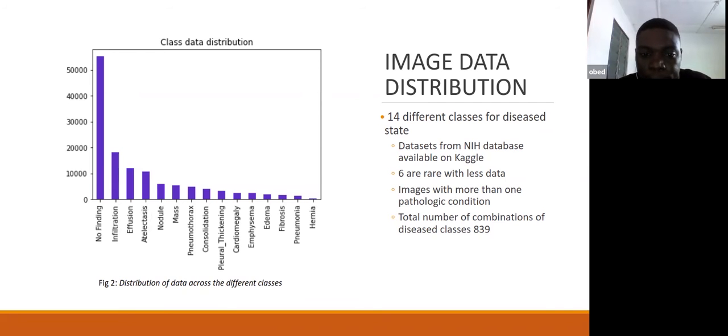Are they related in a tree structure? So you can have an infiltration which is caused by something else, or can you only have one of those classes? Yes. Usually when you have a condition diagnosed as mass, it's also likely to be an infiltrate. It's more like the infiltrates become a universal set, and then the mass is maybe a subset, and you would have a number of them fitting in here and there and intersecting.